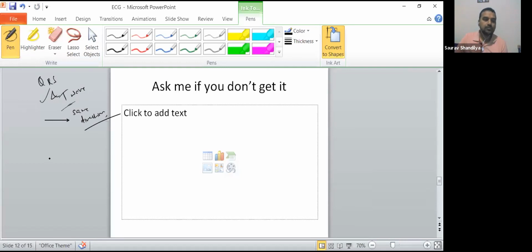Now, lead 1 and lead 2, another important point. Lead 1, this much you should remember. Lead 1 and lead 2 should have positive waves. I don't know what the problem is, it is not working. Yeah, positive waves. That you should keep in mind.